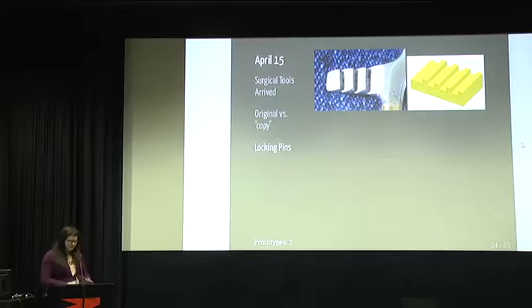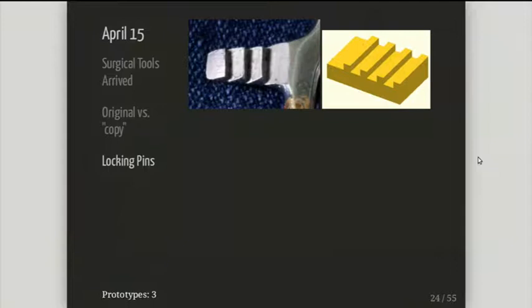There was another thing — the locks. I made a close-up on the locks of the actual hemostat, which you can hopefully see are somewhat angled. So what happens is when you push the grips in, it locks automatically. Mine was just straight teeth, and it wouldn't work that way.